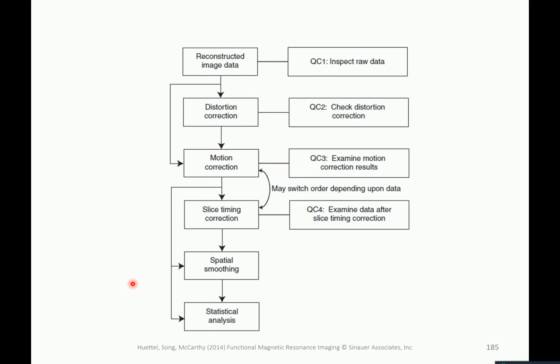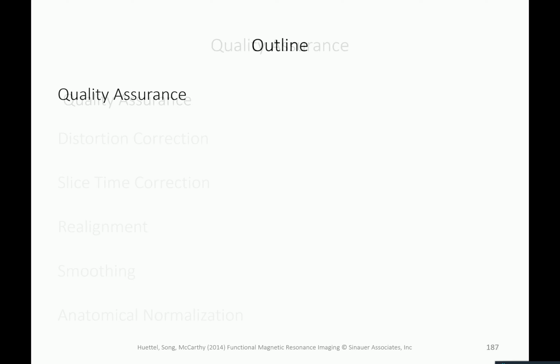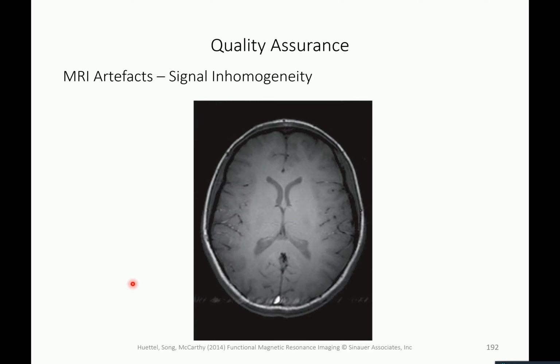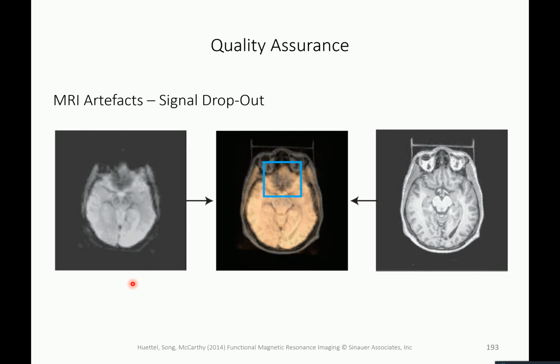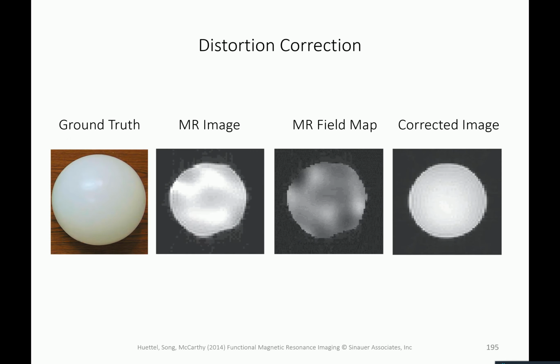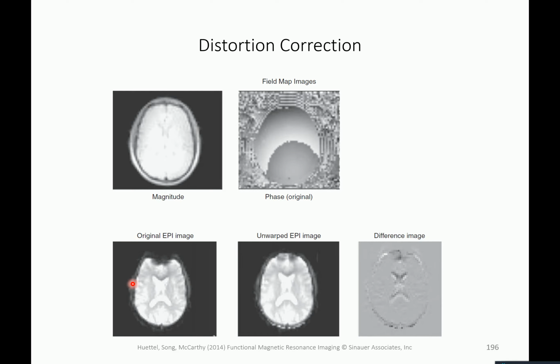The frequencies are not acquired at the same time, but the image points that you get from reconstructing the frequencies, so doing the inverse Fourier transform, are kind of from the same time because they are on average from the whole thing. They are not acquired one box by one, but in frequency space. We have to discuss more to really see that. But in principle, they are acquired at the same time, which means throughout the whole period.